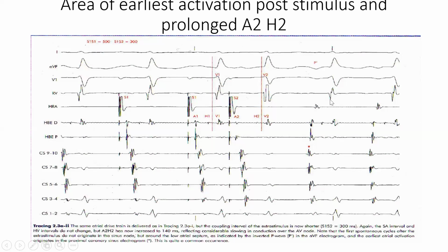So now they didn't pace anymore. So there's sinus node recovery here. There's the His spike, right? There's the V. Are you getting it, sir? Yes, sir. So the same way, A, H, V. No more pacing. There's something I still want to bring to our attention here later, but I want us to get the first basic thing.